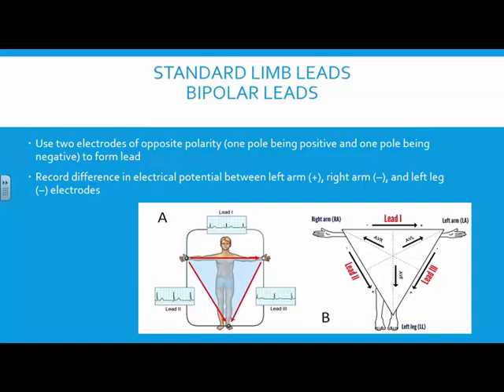That works. All right. This is the chest. Okay? This is the chest. Remember, whenever we're referencing a patient, we're referencing them from the normal anatomical position. So when we say the right, we're talking about the patient's right. Okay? So we've got our right arm lead, which is your white. Which is negative, correct?